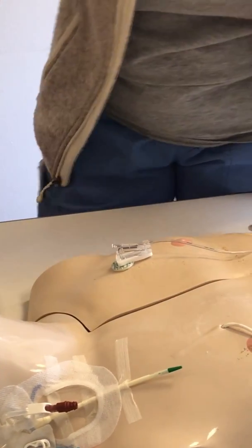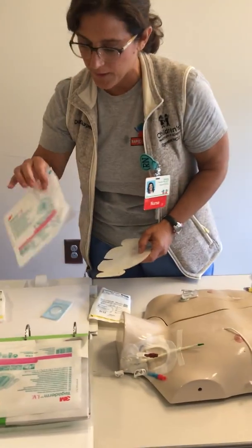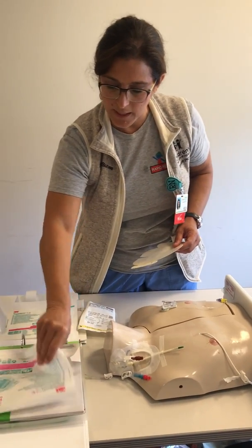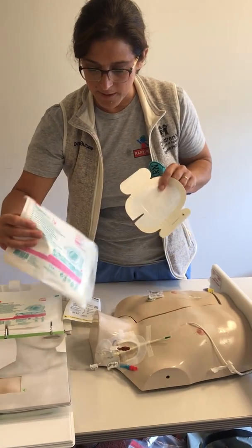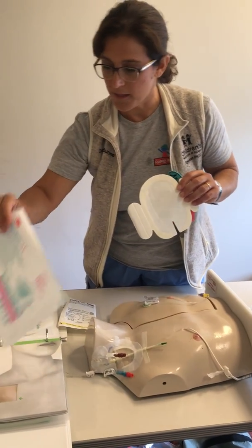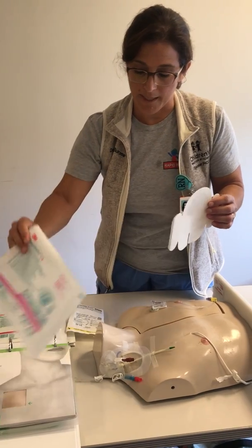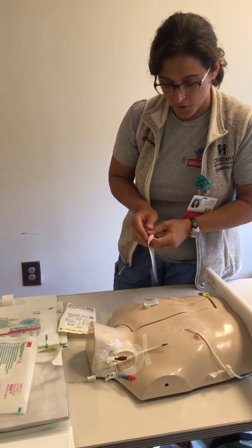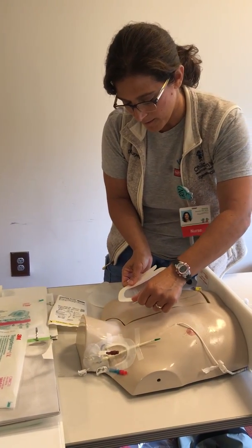Remove the plastic piece, and in the kits they usually come with a standard Tegaderm, but what we like to use is, right next to our dressing kit, we have a larger Tegaderm, and it keeps the port from tenting too much. So if you can get the larger Tegaderm when you get your central line kit, it'll be a lot nicer for the kids. It's not that much bigger, but it definitely is nicer for a port.